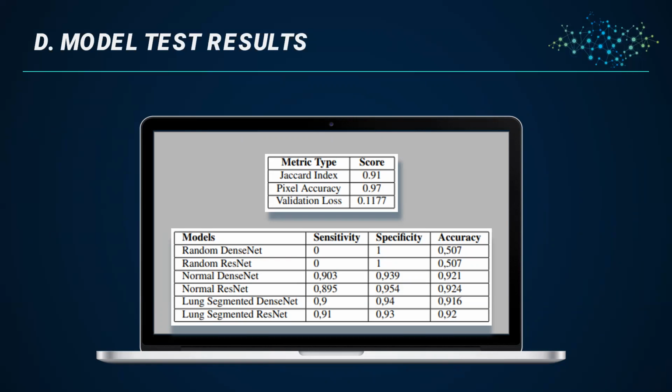There was no superior relation between models with or without lung segmented support. Both settings were on par in the normal class. In all cases, the models performed similarly, considering the selected metrics. That result alone might discourage the usage of segmentation in practice, only in terms of classification.